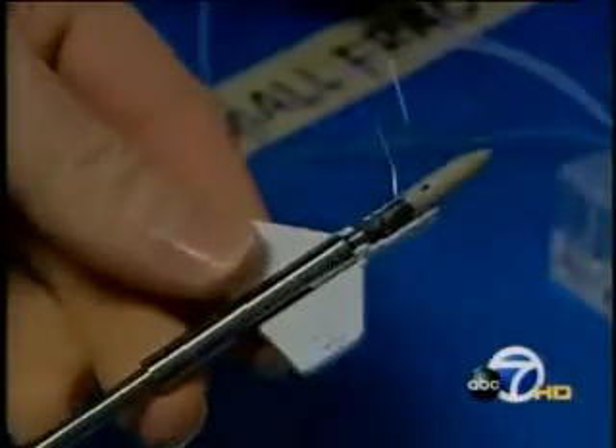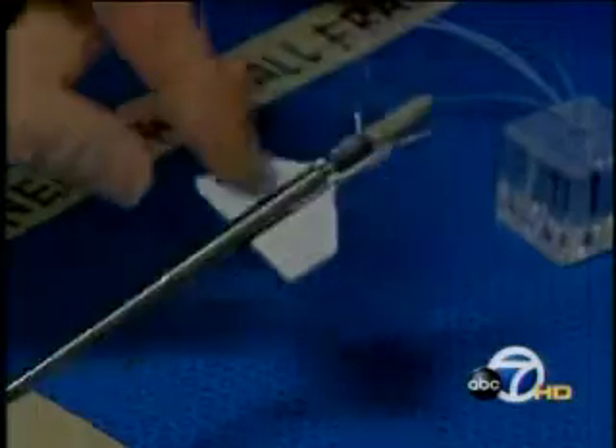With standard rotator cuff surgery, doctors make a large incision in the deltoid muscle to reach into the torn tendon and sew it back into place. Dr. Halbrecht has invented a simpler, minimally invasive way to do the same thing. This is the Versalock anchor — he uses this device to more quickly anchor sutures and ligaments to the bone.